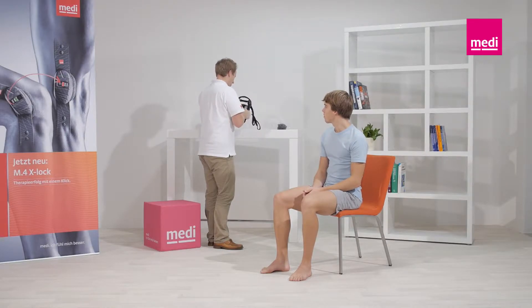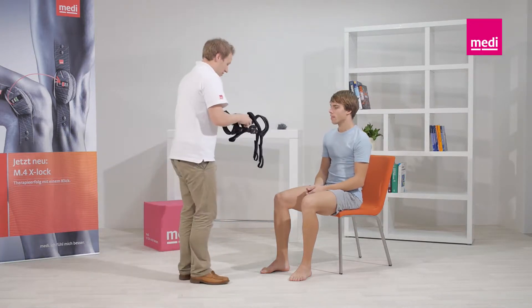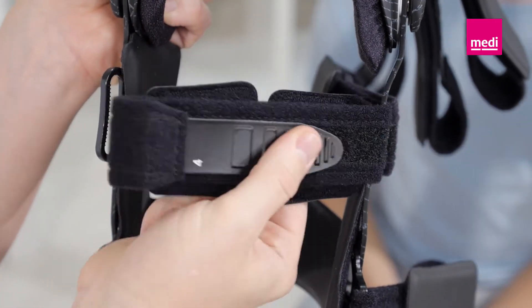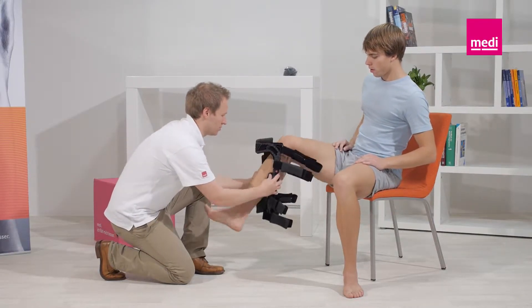The orthosis should be worn directly next to the skin to ensure the best possible fit. Make sure that all the straps are open. To prevent incorrect fastening of the Velcro straps, it's recommended to close them again afterwards. It's best if the patient sits on the edge of a chair.